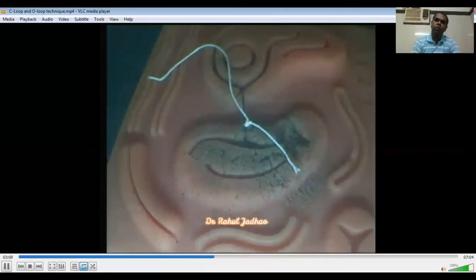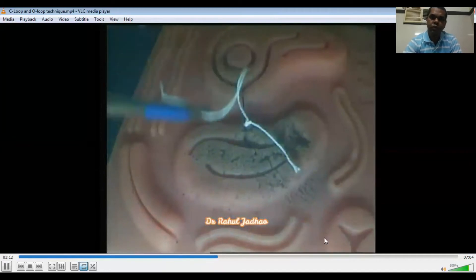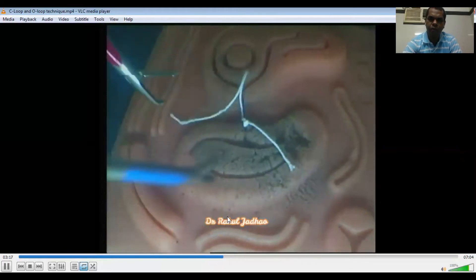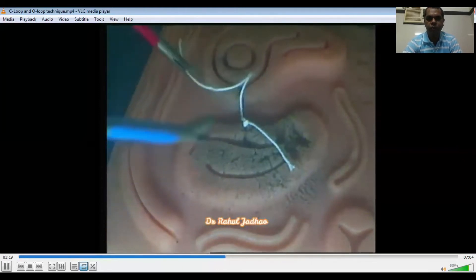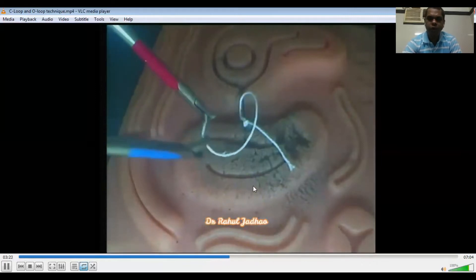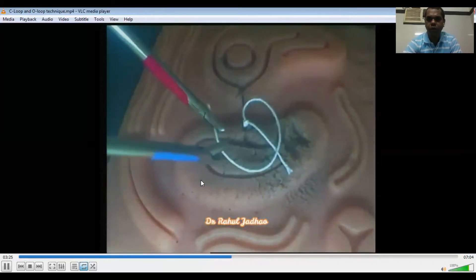Now we will see the O-loop technique. My preferred technique is the O-loop technique, because one can tie the knots very quickly.